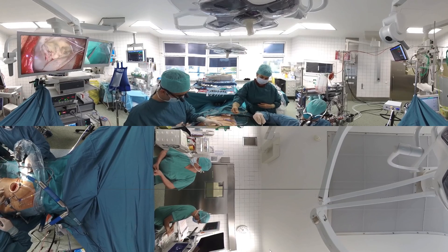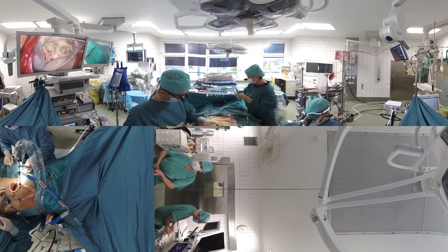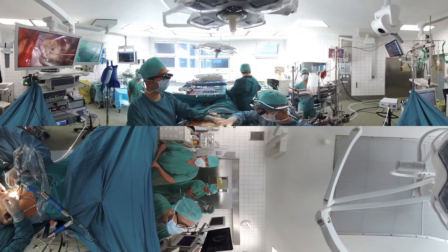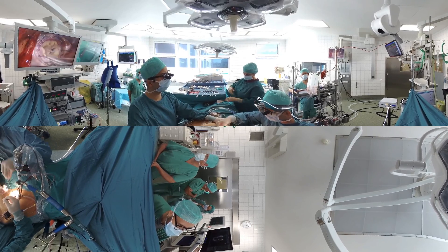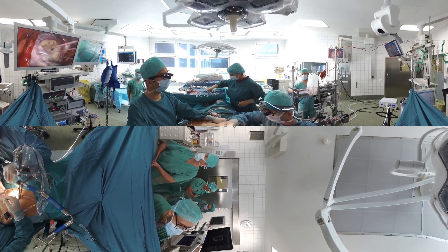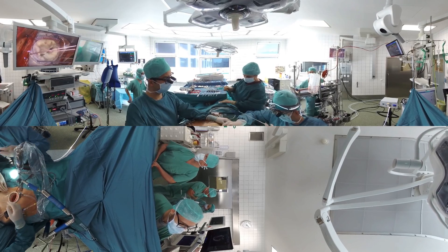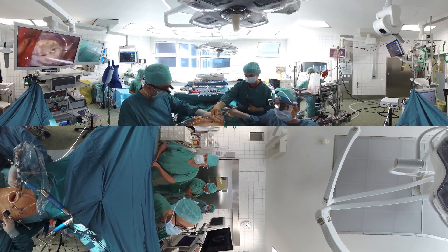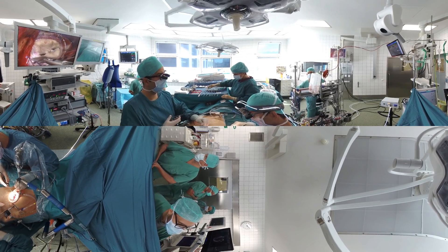Several braided sutures are now placed around the mitral valve annulus, that is the area where the valve leaflets join with the left atrium and left ventricle. These sutures are then passed through a supportive ring. The ring is lowered down onto the mitral annulus and the braided sutures are separately secured with a knot pusher.